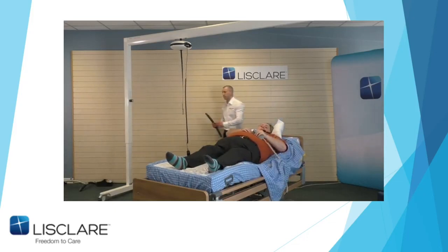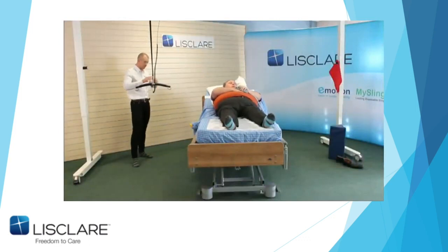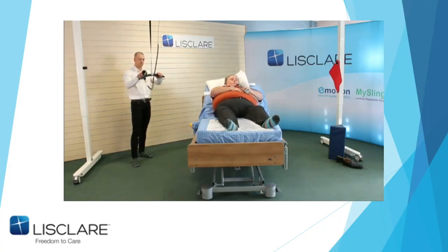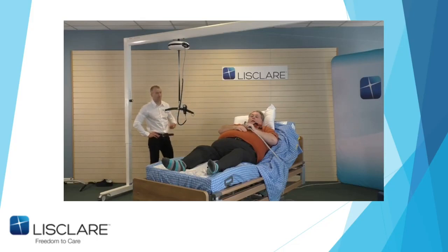because my pelvis is rotating. And that's one of the main reasons why clients do not like the community care beds, and they usually get extended out. If I just wiggle myself about and just relax the knees, as you can see, it brings me into a better position. There you go. You can actually see now my head's above the mattress. And I haven't slid down. Lucky enough with 2 camera angles, which we're trying for the first time to make sure it works, and it seems to be. So you get the idea.